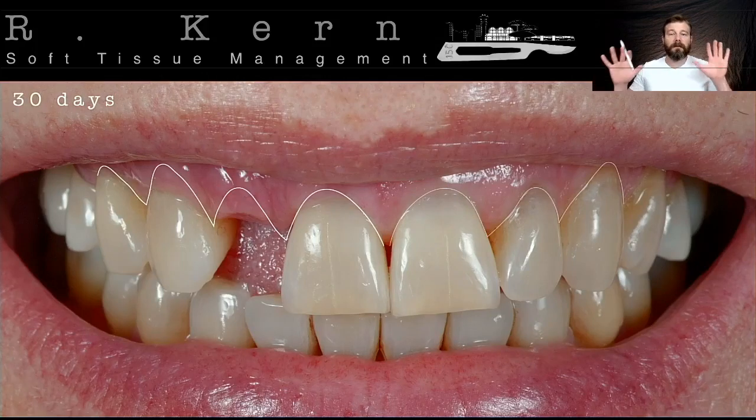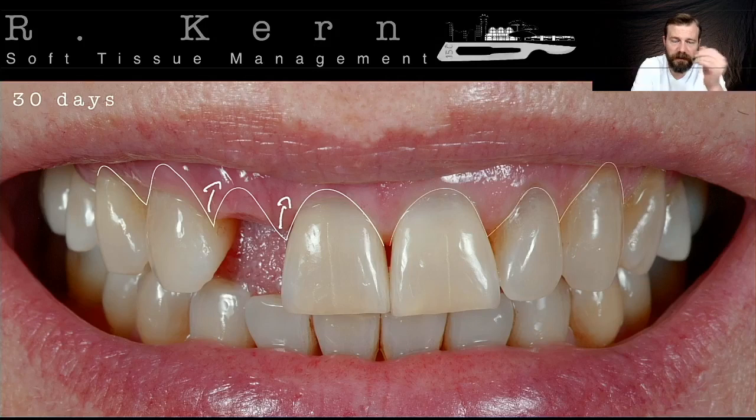You see now the same treatment plan from the beginning, the digital design over this picture, and more or less we are achieving the symmetry for this patient. Maybe a second CT graft is going to be necessary if I have this area receding a little more. Let's decide that later, and probably this is a case that I'm going to update you on, with the sequence of this case, okay?